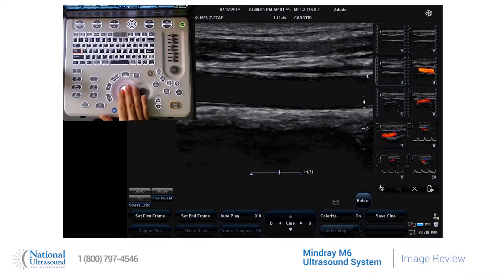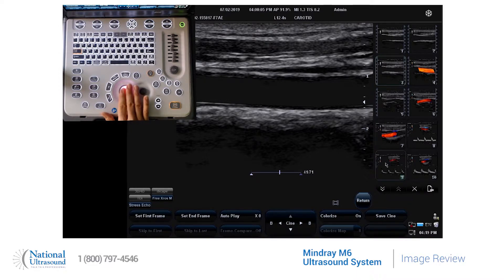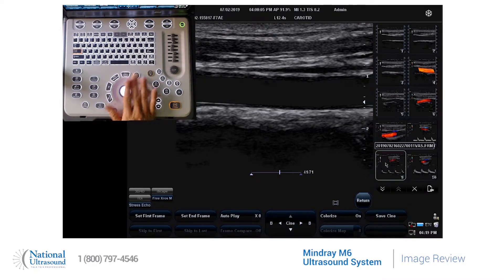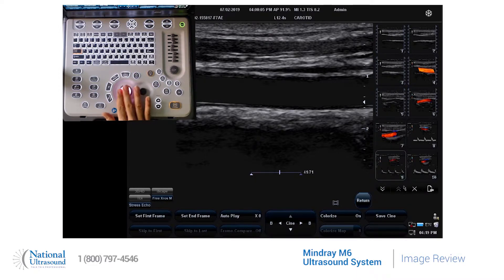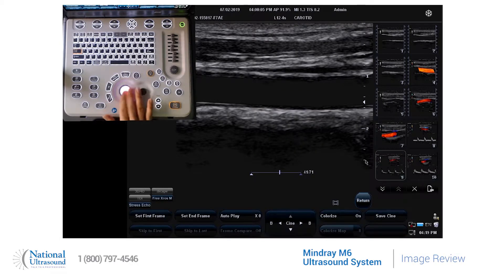Below the images are arrows that will allow you to scroll down or up through your images. If you highlight an image once and press the X, it will allow you to delete that image.